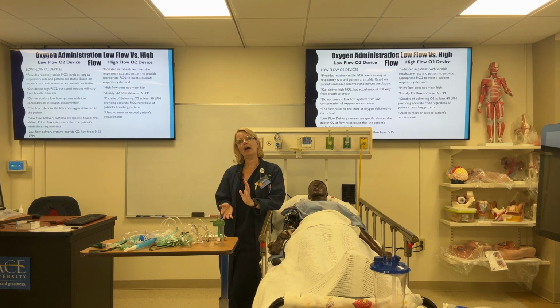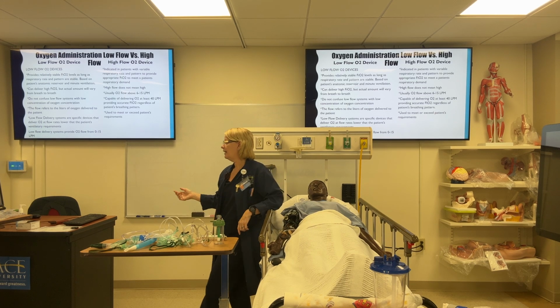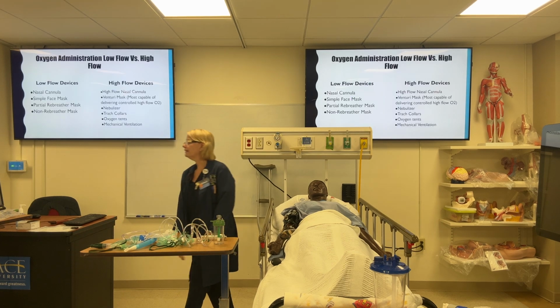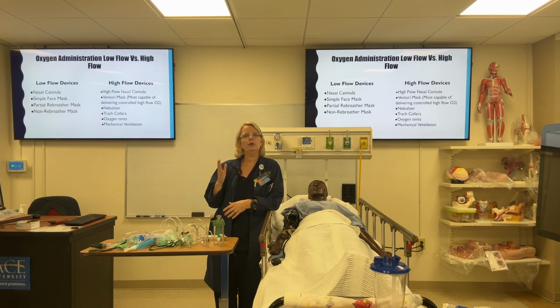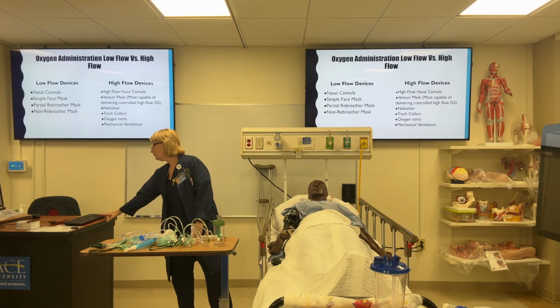And so you'll see high flow device, low flow device, what does that mean? If you look at, I think it's the next slide, sorry, 2 more slides, I have them divided up as to which devices are considered low flow devices and which devices are considered high flow devices. And again, I'm going to go over each one of these devices with you guys.